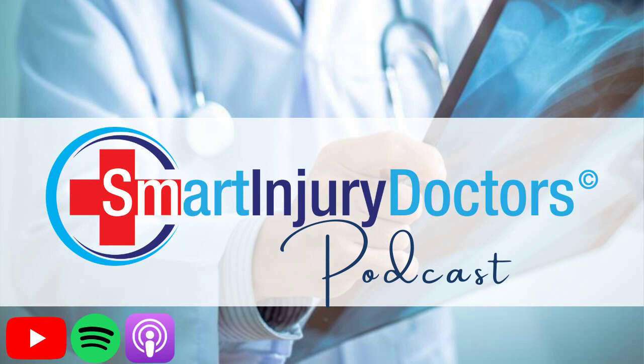What is it that they're looking for? They're looking for fracture. They're looking for gross misalignment, which is fracture. They're looking for cancer, infection, serious conditions, which the majority of the time they're not going to see, especially in a trauma, when a person is coming in and having an X-ray series due to trauma. They're looking for degenerative changes. That's what they're looking for, right? They're not looking for excessive motion. You can't see excessive motion.